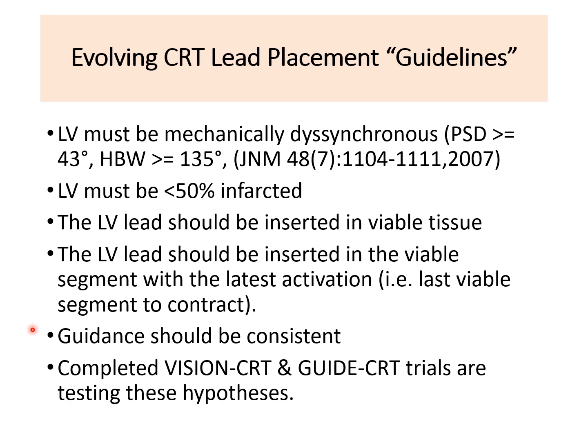and that you require a technique that is consistent, meaning it's as automatic and simple to do as possible, so that experts in a core lab, for example, will get the same results that independent sites in different parts of the world would get with the same patients. And to prove all this, 2 major prospective trials have just been completed.